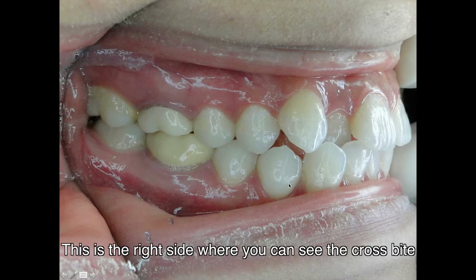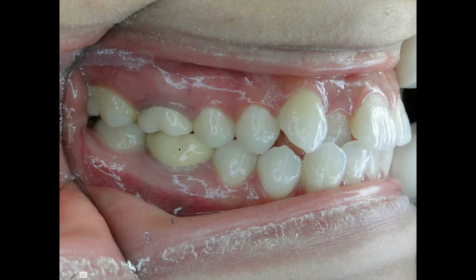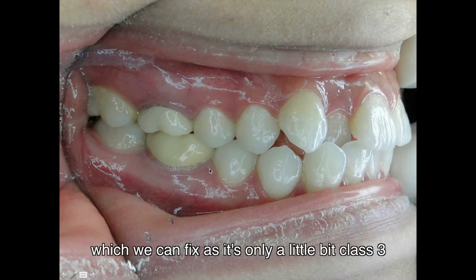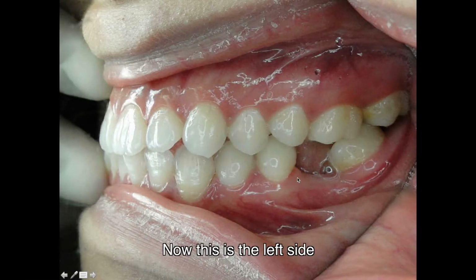and this is the right side. You can see the crossbite. You can see the molar relationship is slightly class 3, as I predicted when I looked at your face, slightly class 3, which we can fix. It's only a little bit class 3. Okay, next. Now this is the left side.